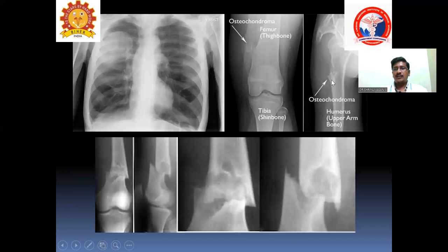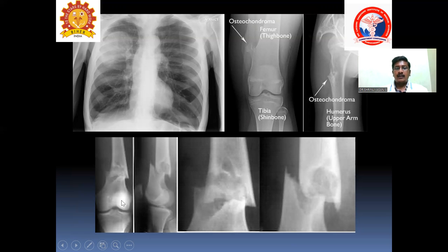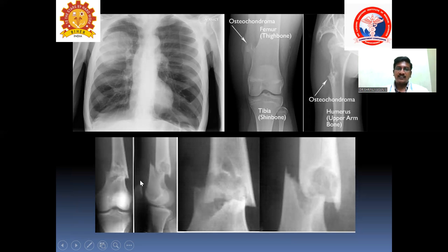This is a pathology of traumatology, showing how x-ray is useful in trauma. We take an AP view and lateral film so you can see the fracture line — the discontinuity of the bone and how it is displaced. In the AP film you can see lateral displacement, and in the lateral film you can see posterior displacement. There is a fracture involving the distal femur with posterior and lateral displacement of the proximal fracture fragment.